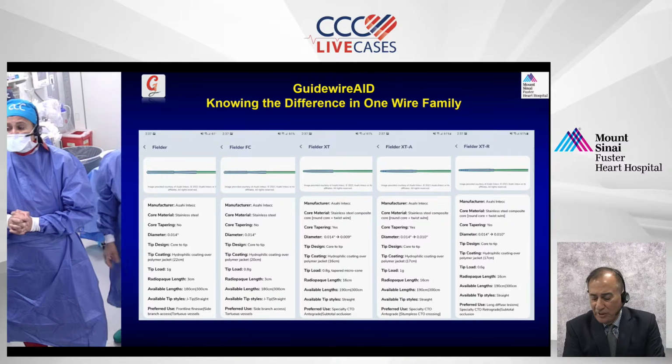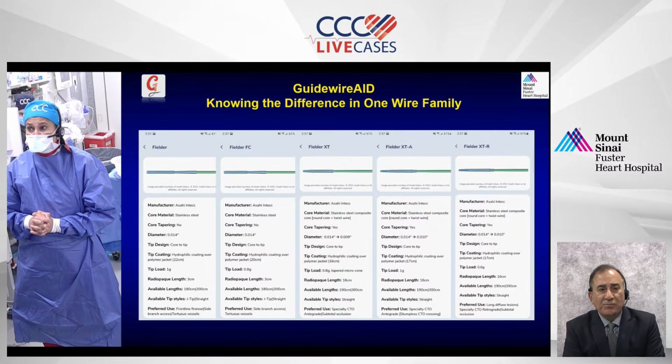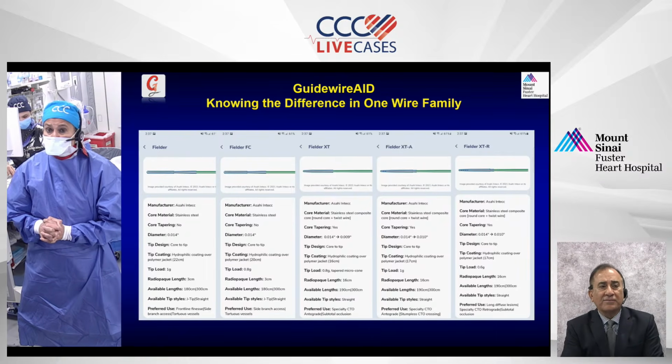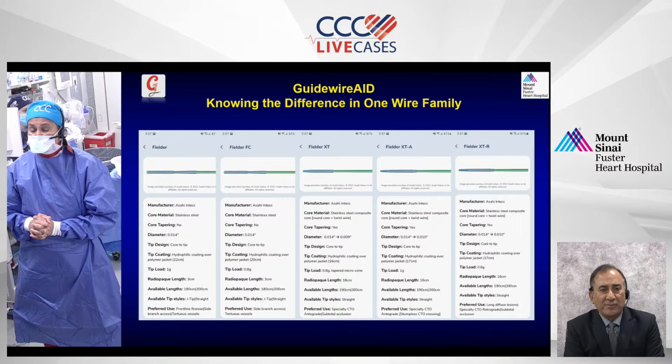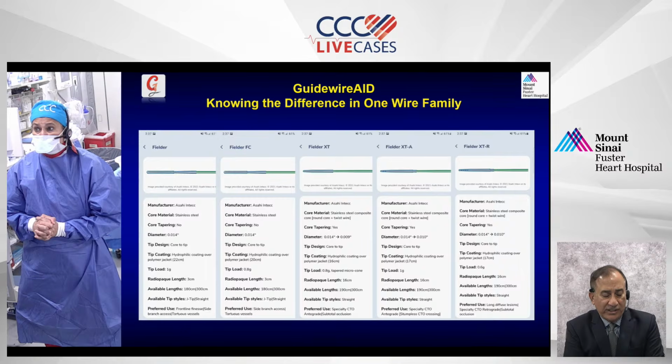Excellent techniques, multiple wiring of challenging lesions, just a beautiful case. And I think the handling and placing of the final stent was outstanding. Great guidance by imaging. Overall, an outstanding case. I've had many congratulations for your skills from viewers.